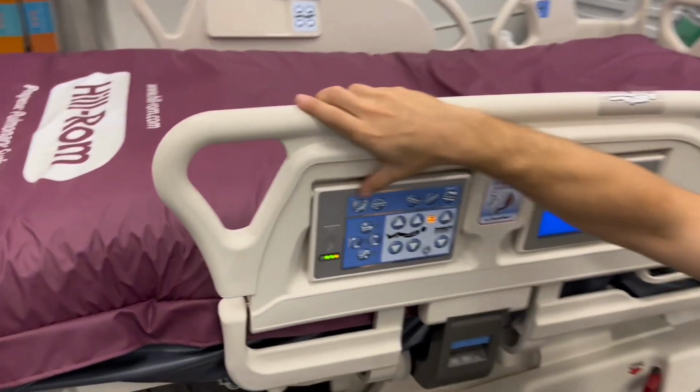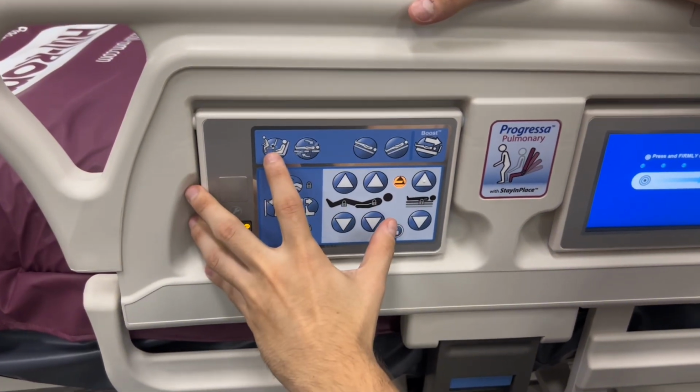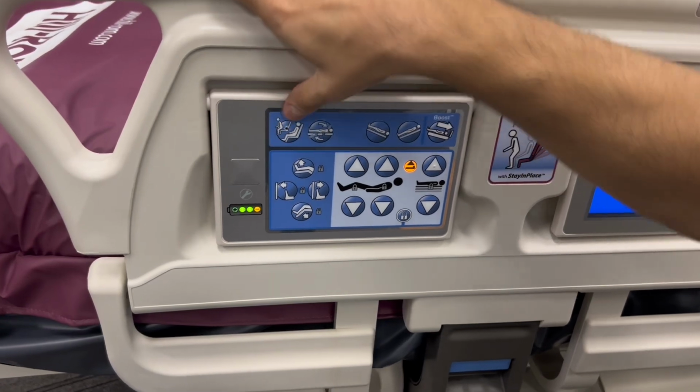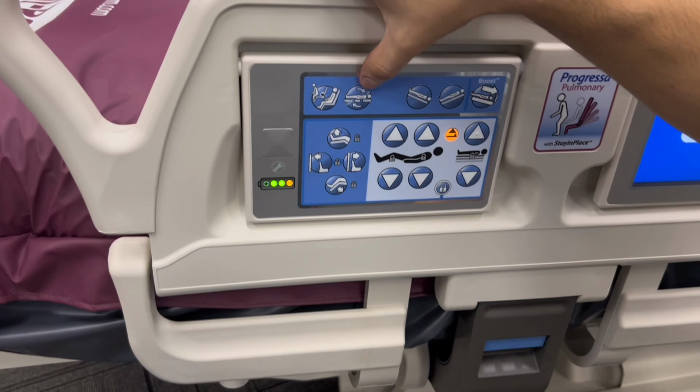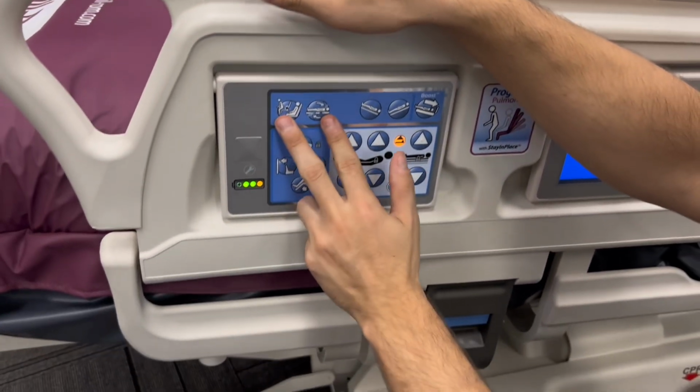Some of the other ones that we have here are going to be our chair button. So this button here, we're going to do a whole separate segment on in a little bit, but it's going to turn the bed into a full-on chair where you're able to stand up and get out of it, as well as the reverse, which is going to take us back from that chair to a bed flat position. So we'll dive into that in a little bit.